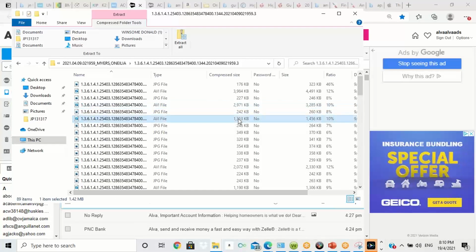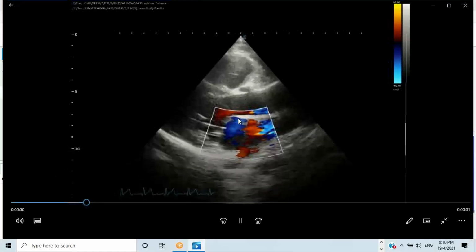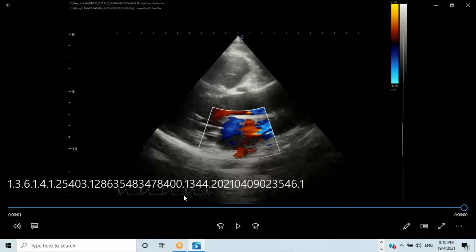So we put our color flow across the aortic valve, and we put it across the mitral valve. Remember, the color is coded, and flow towards the transducer is going to be shades of red, and flow away from the transducer shades of blue. So similarly, we'll put it across the mitral valve. Okay. So again, you must always locate your transducer. Transducer is right there.